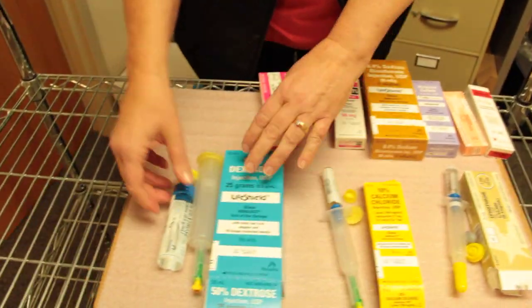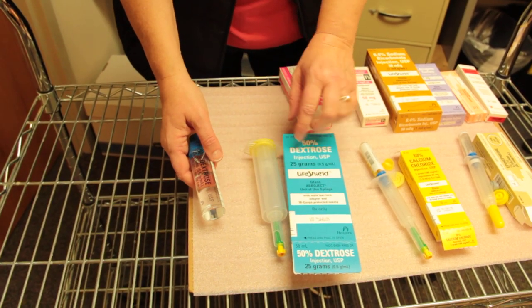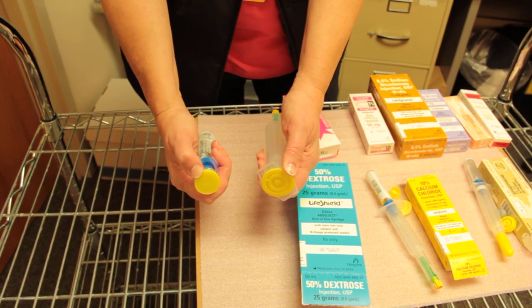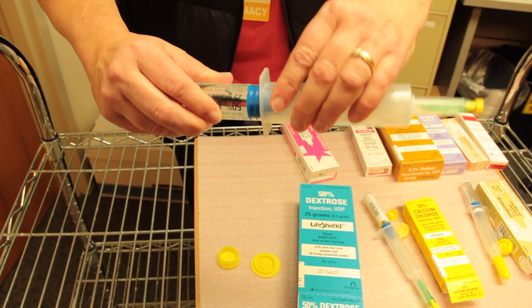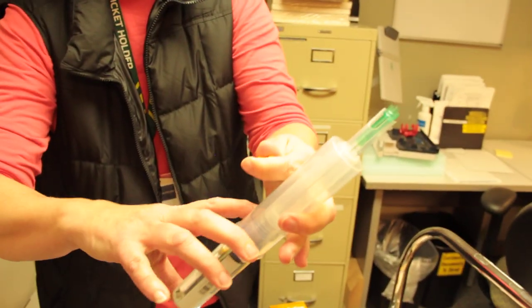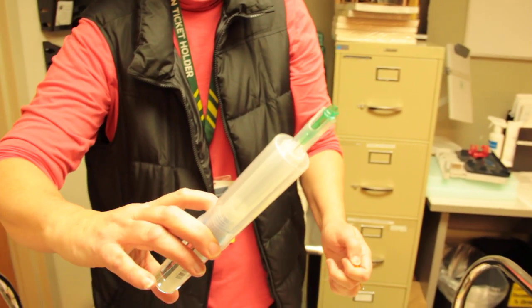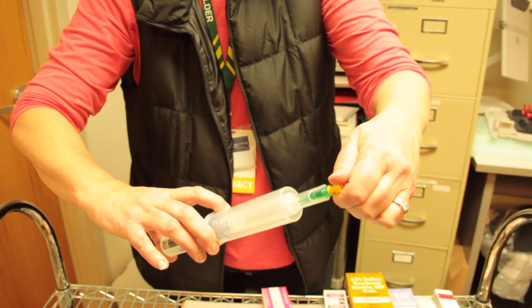One example you'll see, which gets used more commonly for low blood sugar, is dextrose syringes. It has the green needle in there but these are just the same thing, only a bigger syringe. You flip the ends off, tighten the two pieces together, remove the yellow cap, and then it works like a regular syringe. Push the liquid up — you'll see it come out a little bit — and then administer through a running IV site or an IV site already in place.